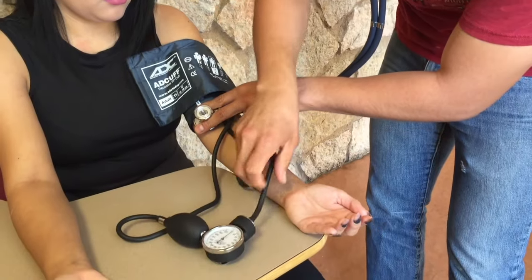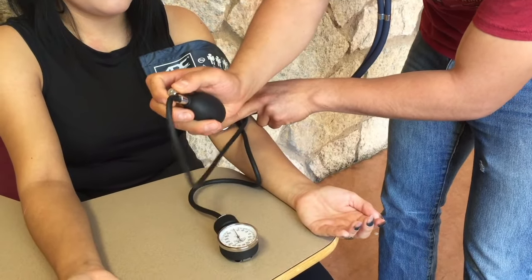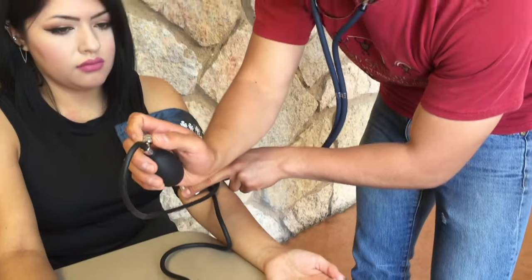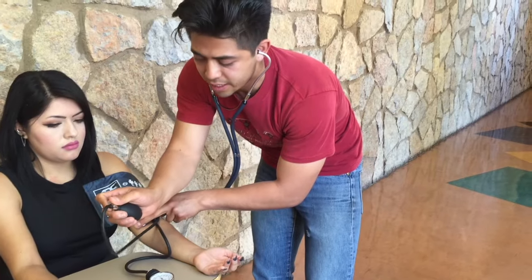Place your gauge at an appropriate distance and viewing point. Assure that it is tightened to the right all the way, but not too tight so that you don't have issues untightening it.